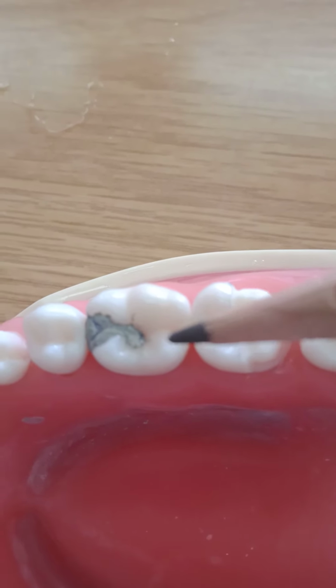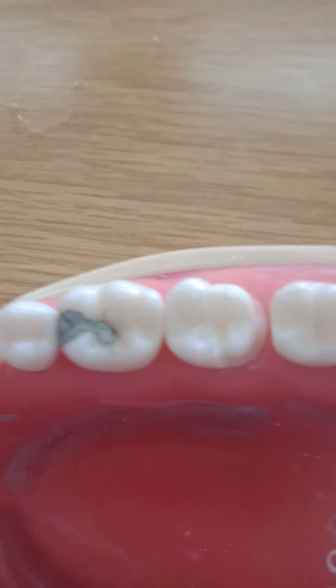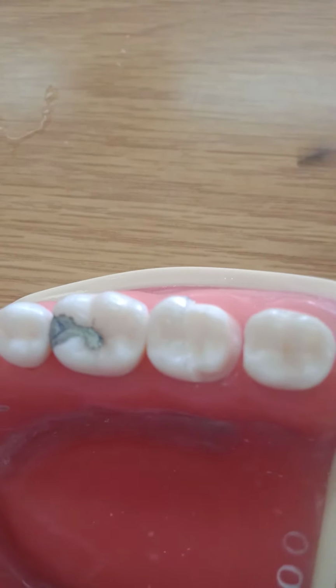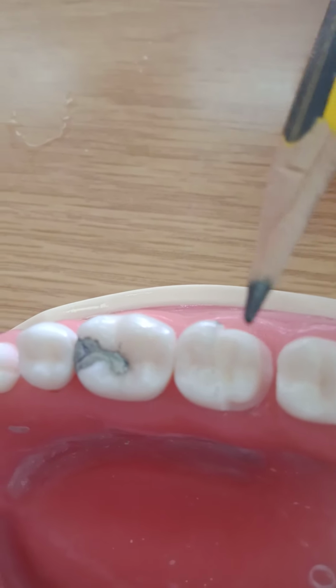This is a case where we have a half crown. You've chosen the mesial as the surface that you want to keep intact, right? Usually, is it mesial or distal? Usually, in clinical cases, it's the distal surface we keep, not the mesial.